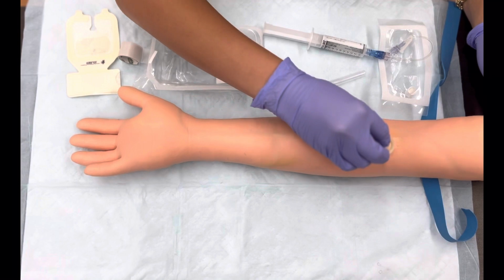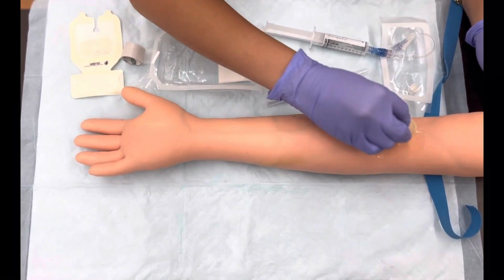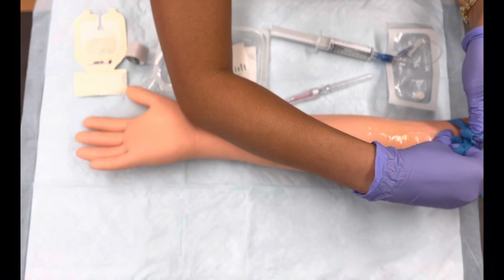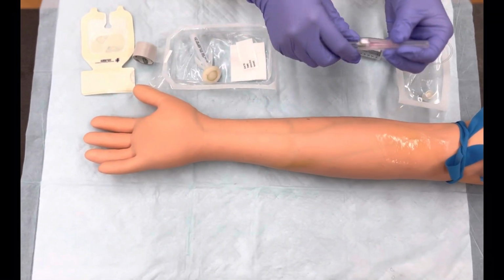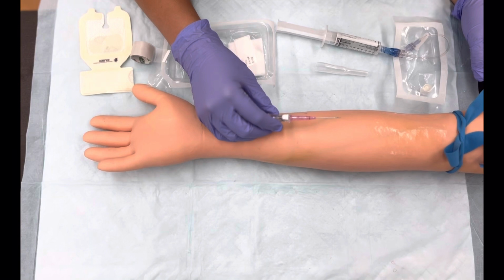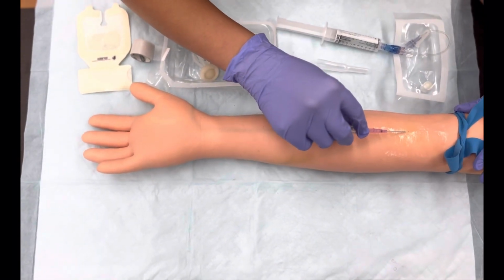Cleanse the insertion area, allowing it to dry completely, and refrain from touching the cleansed site. Reapply the tourniquet properly. Next, perform venipuncture. Anchor the vein below the site and instruct the patient to relax their hand. Warn the patient of a sharp stick and insert the needle appropriately.